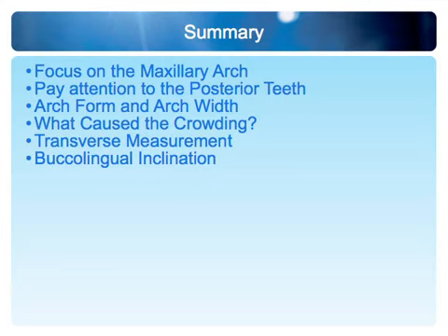And the more and more I addressed the posterior teeth and I uprighted them, the more I saw there was no need for occlusal adjustments at the end of the cases. Because when you have that buccolingual inclination established, you have the right occlusion. So, almost always you're going to be expanding or uprighting those posterior teeth into a better occlusal scheme, not a worse occlusal scheme.